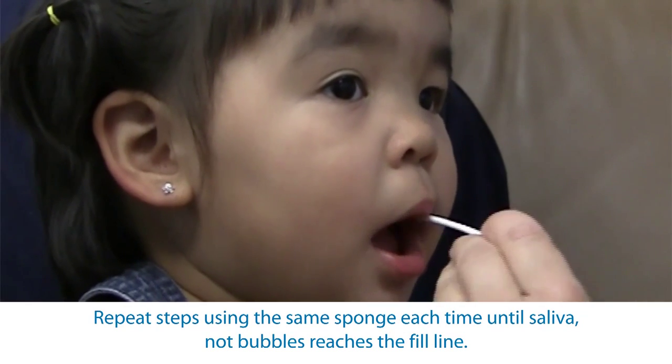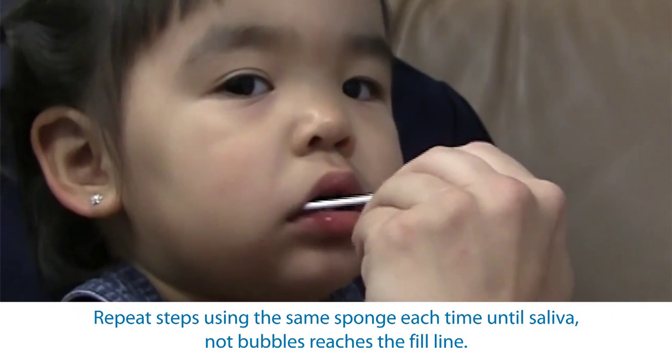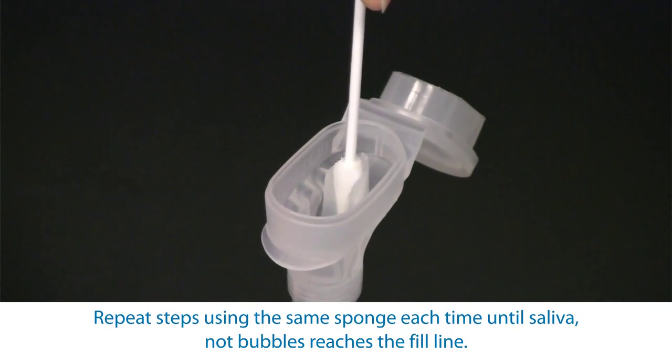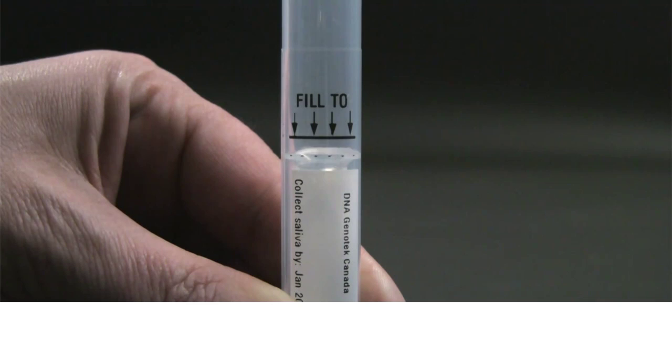Repeat these steps using the sponge until saliva, not bubbles, reaches the fill line. You will find the fill line on a label on the side of the tube. Check the sponge for damage each time before inserting it into your child's mouth and replace with a spare sponge as needed.